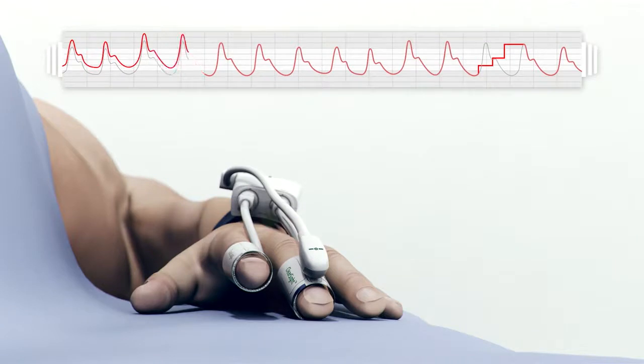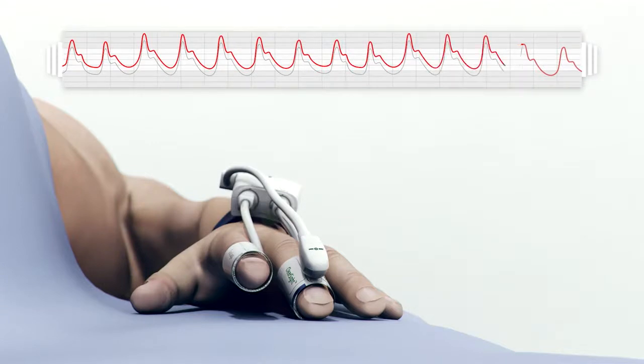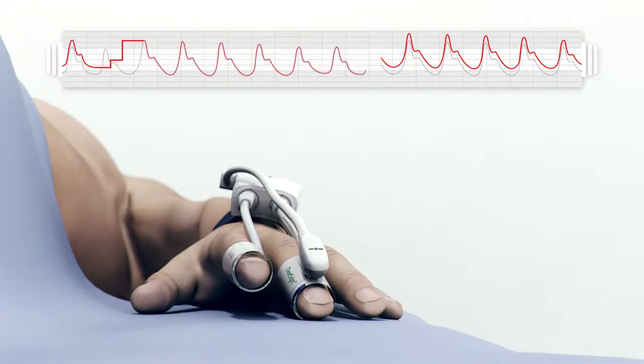Physiocal periodically recalibrates the system, which is essential for tracking the set point when smooth muscle tone changes during events such as vasoconstriction, vasodilation, and temperature change. This calibration initially begins at 10-beat intervals and increases to 70-beat intervals depending on the stability of the finger physiology.